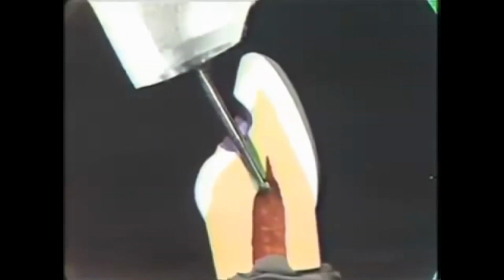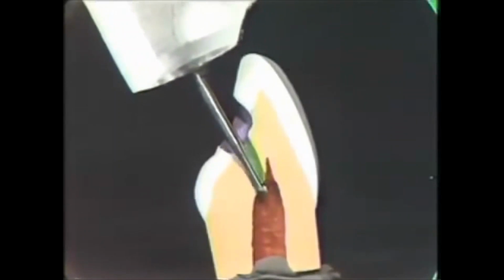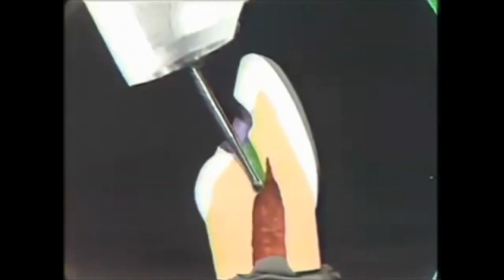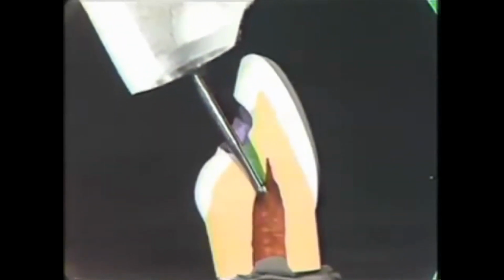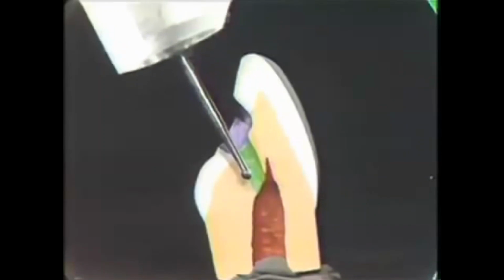Once again, you'll feel the burr fall into the pulp chamber as there's a sudden reduction to the drilling pressure as you enter the pulp. Now, if you really get lost and you feel like you just don't know where the pulp is or what the angulation of the tooth is, you may want to stop and take a radiograph.